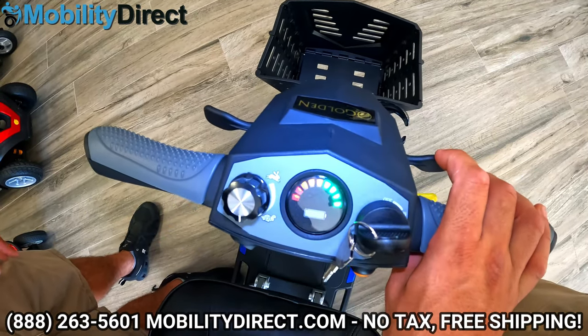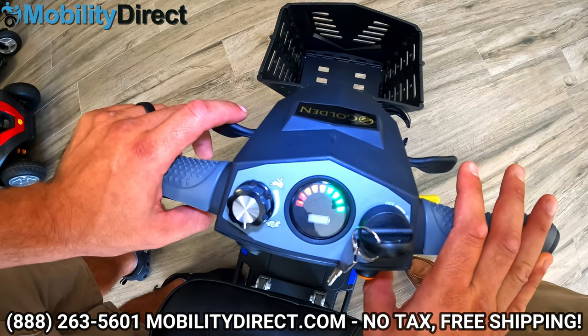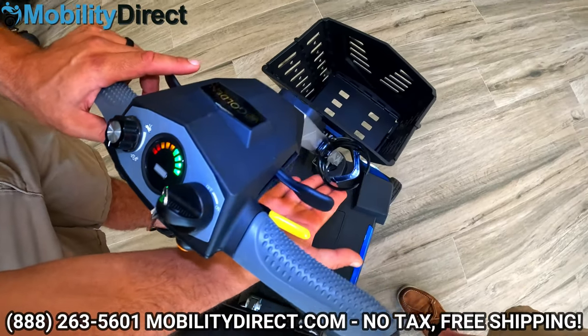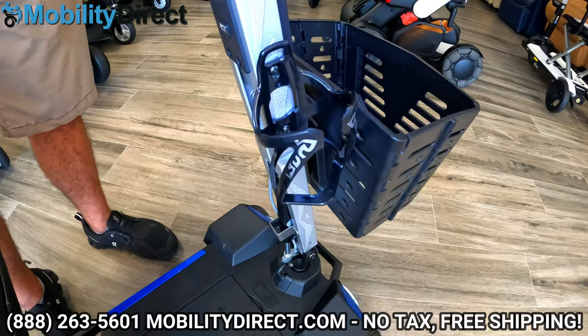It's very convenient, especially for people that have limited dexterity or can only use one hand. It's also convenient if you have a drink in one hand — though we don't condone drinking and driving your scooter. If you do want to carry a drink with you, you have that cup holder. Plenty of space in the basket as well, which it comes with free of charge.